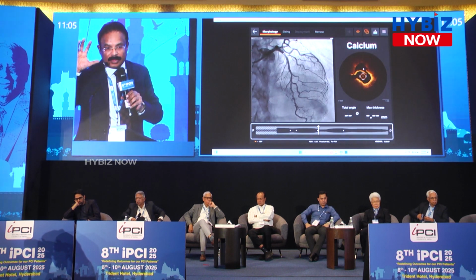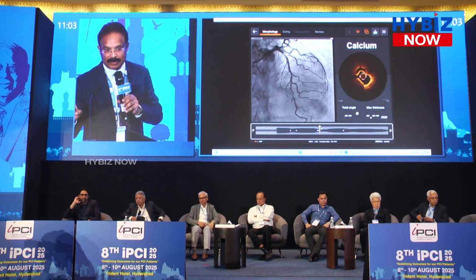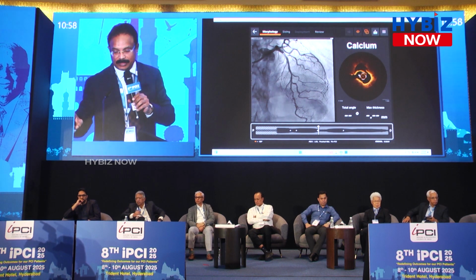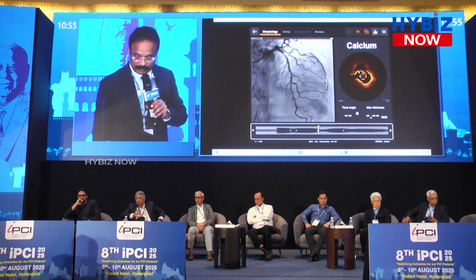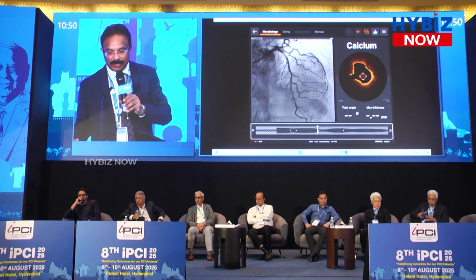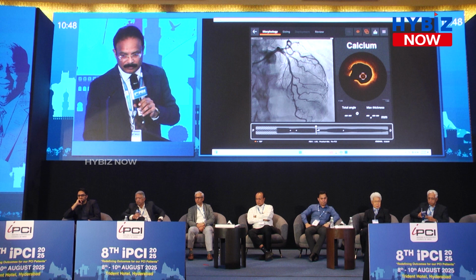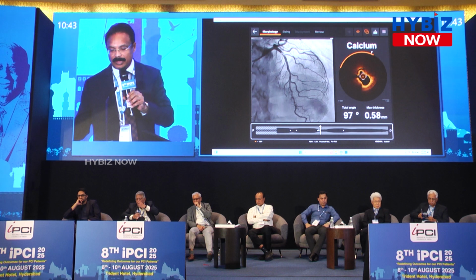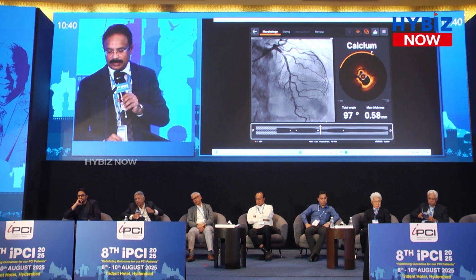So you have seen the classical plaque rupture in this view, the classical previous one. You can see it's mostly the lipid-rich area, and inside the lipid-rich plaque, you can see the cavity, and the integrity of the fibrous cap is lost. You can clearly see the loss of the fibrous cap integrity, or the broken fibrous cap. This is the classical plaque rupture, and it's a lipid-rich plaque. There is some amount of fibrosis, but the fibrotic component is much less when you look at the predominant lipid part. There are some small islands of calcium also.